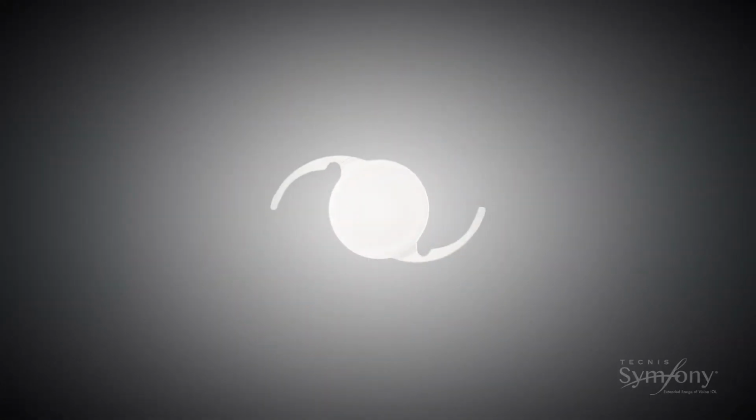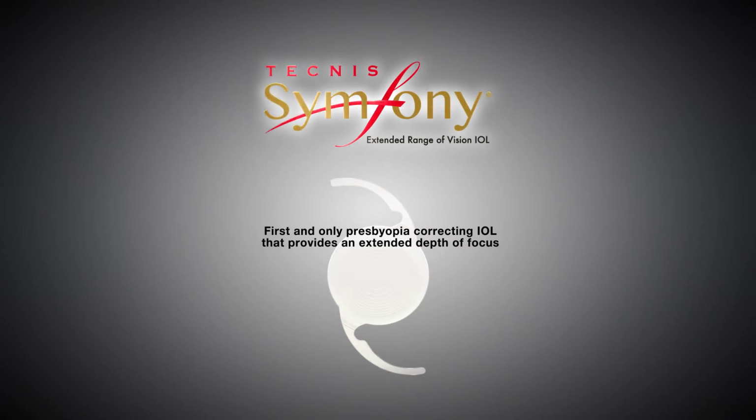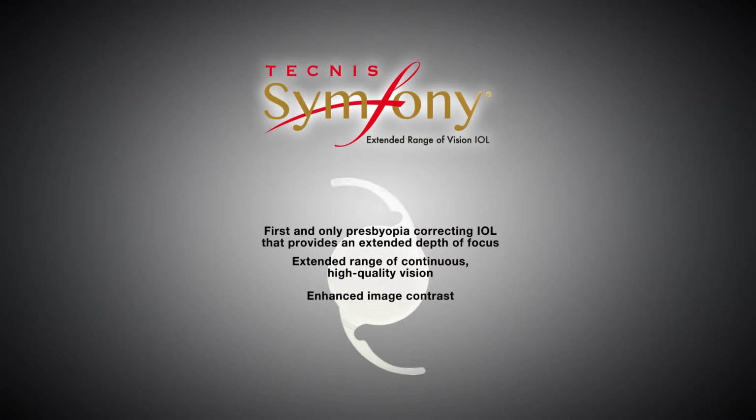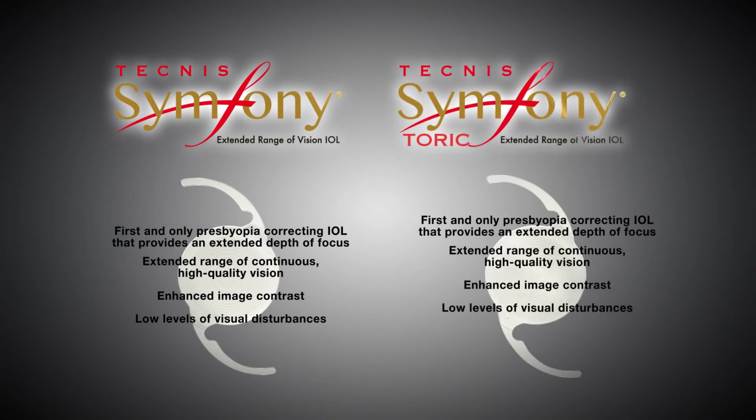The Tecnis Symfony IOL is the first and only presbyopia-correcting IOL that provides an extended depth of focus, which results in an extended range of continuous high-quality vision with enhanced image contrast, as well as low levels of visual disturbances. In addition, the Tecnis Symfony Toric extended range of vision lens provides all the benefits of Tecnis Symfony IOL technology for patients with astigmatism.